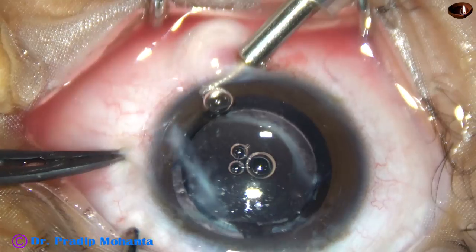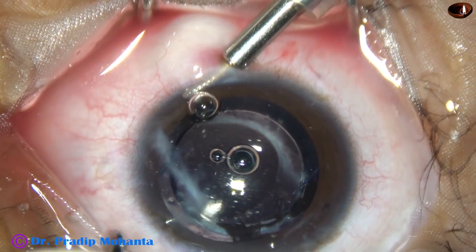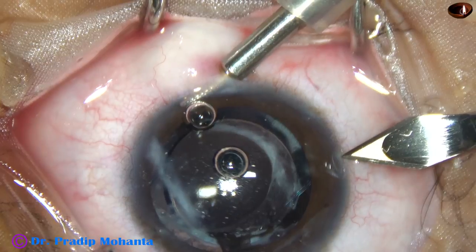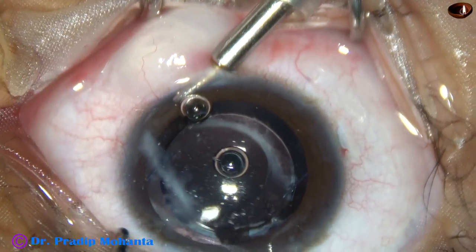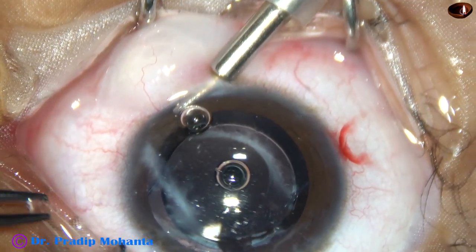This is an incision at the limbus for introduction of an anterior chamber maintainer. The anterior chamber maintainer has been applied and now an incision is going to be made at 9 o'clock. The anterior chamber maintainer has been placed at 6 o'clock. This is the incision at 9 o'clock.